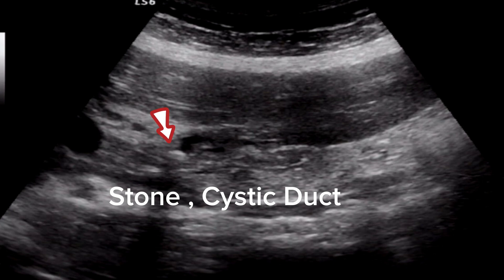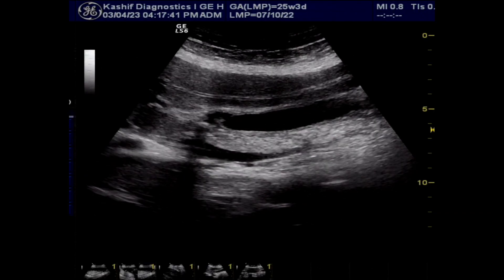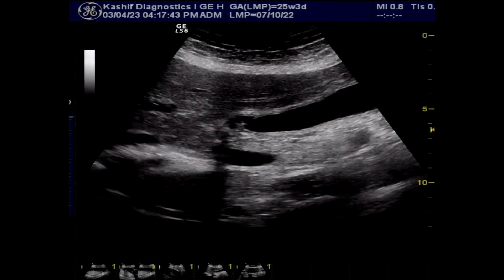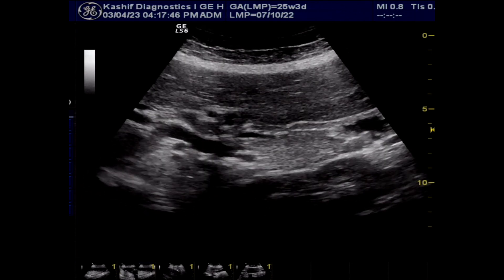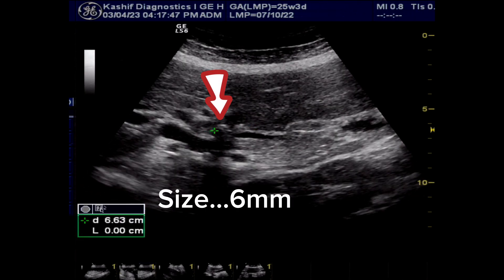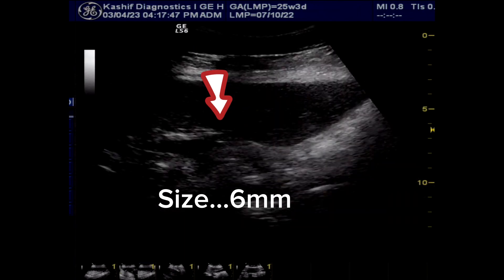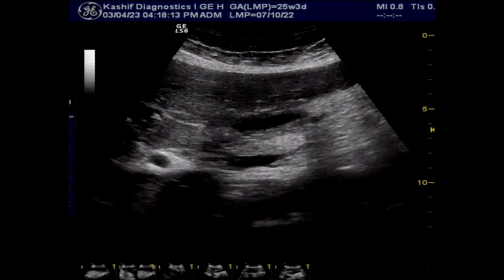This is a bulky, overweight patient. The gallbladder and CBD scan is a difficult scan, and the CBD should be tried to be visualized in all available positions, with normal breathing and with the patient holding a deep breath.